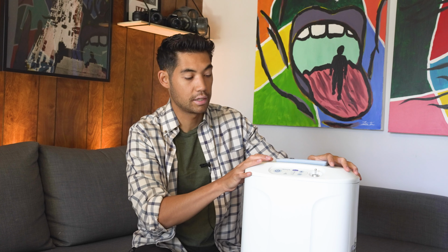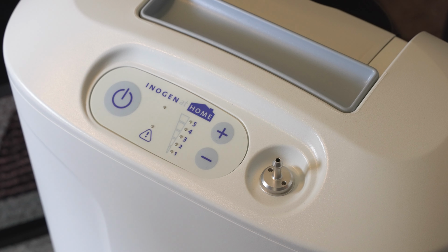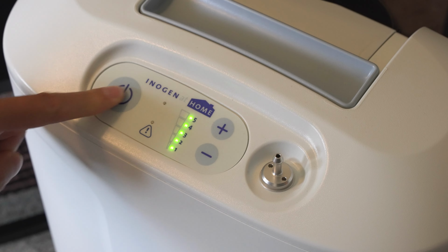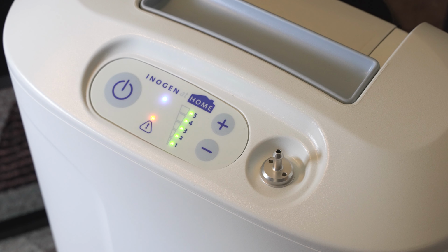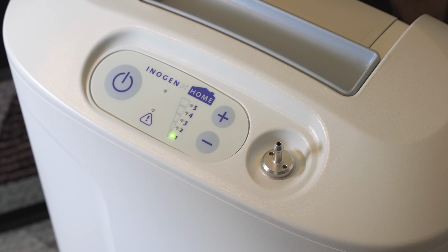So on the top of the machine here, we have this power button up top. Then we have some settings. It says 1, 2, 3, 4, 5, and a plus and minus. Now, unlike the portable concentrators, it doesn't have a screen. You'll see some of the other ones have a screen. This one's a lot simpler, just the plus and minus.